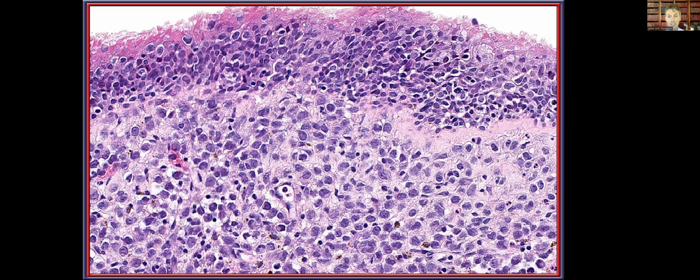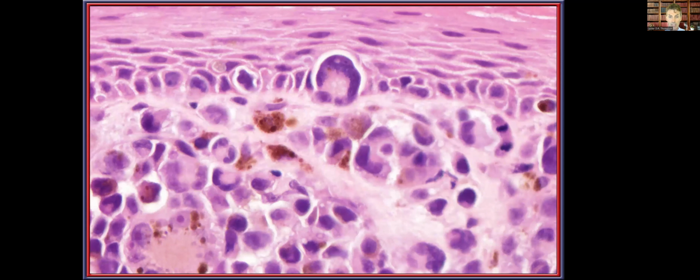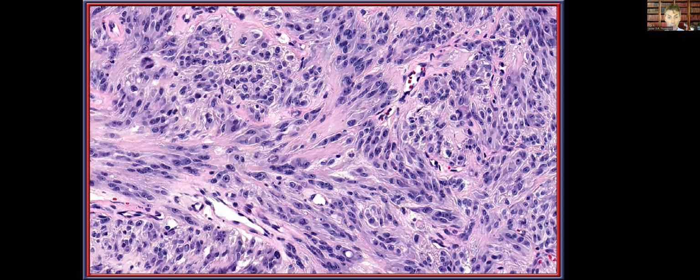So here you will notice the neoplastic cells in the overlying surface epithelium and then dropping off into the stromal component. A nice neoplastic cell present here, right at the junction in a metaplastic squamous epithelium of the nasal cavity. Clearly, the pigment is easily identified here, and so melanin pigment would help you with your overall interpretation. However, if you had a case like this that is a bit more spindled to epithelioid in its architecture without any obvious pigmentation, it then becomes a little bit more challenging.